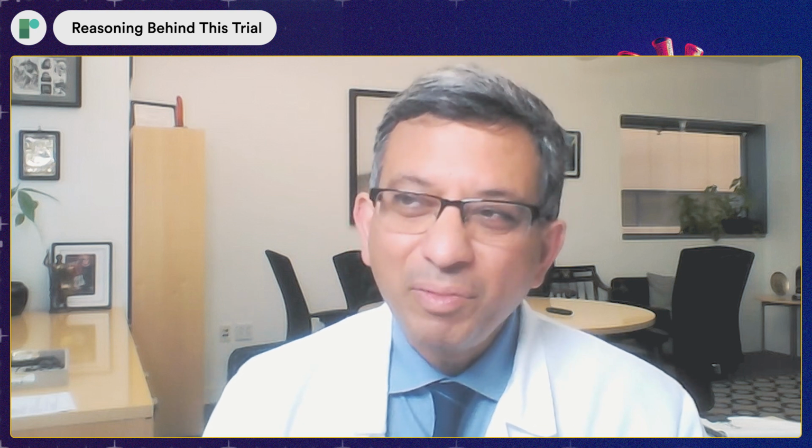So in 2016, the TAVR valve was approved for intermediate risk patients, and the WATCHMAN device was approved for patients who have atrial fibrillation to prevent bleeding or complications related to stroke. The idea was that 40% of the patients who are undergoing TAVR have atrial fibrillation, and they are at high risk of bleeding, and they are at high risk of stroke. So the idea was that many of these patients would benefit from a WATCHMAN device, and then all these old people have to come back again to the hospital and have the WATCHMAN device placed.